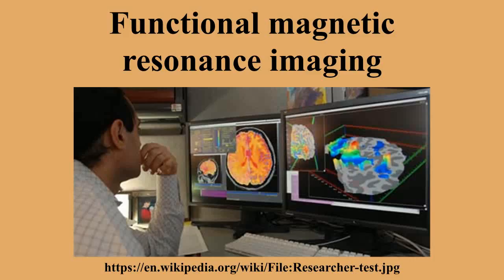Because this response is a smooth continuous function, sampling with ever faster TRs does not help. It just gives more points on the response curve obtainable by simple linear interpolation anyway. Experimental paradigms such as staggering when a stimulus is presented at various trials can improve temporal resolution, but reduce the number of effective data points obtained.